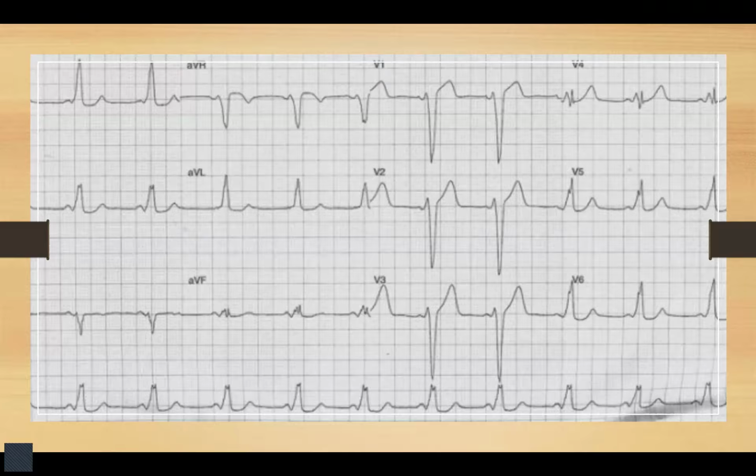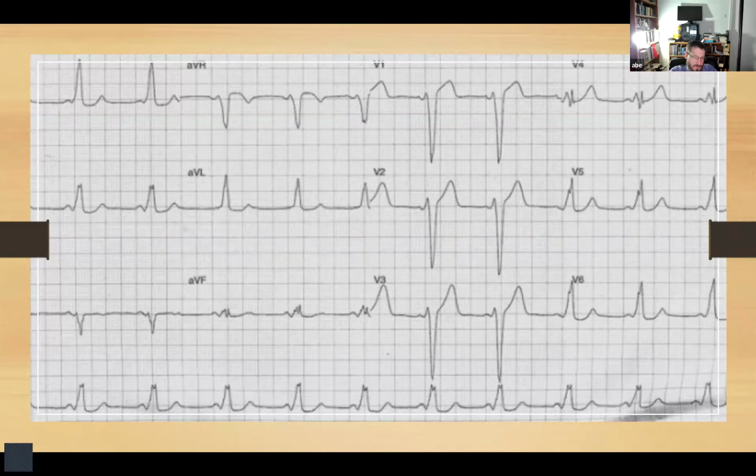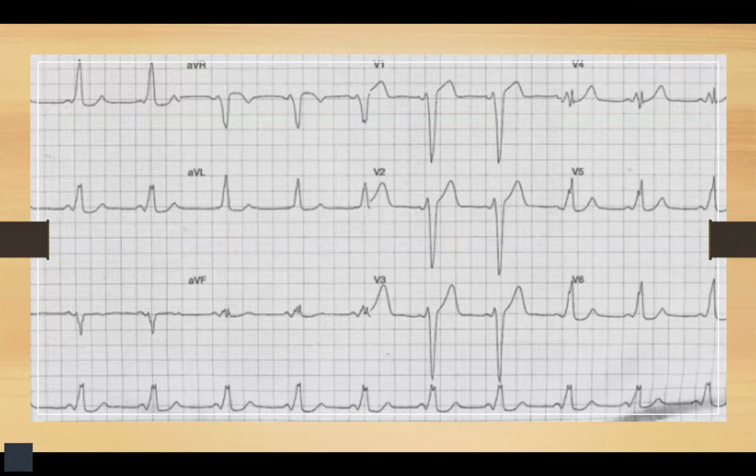What do you guys think about the rhythm strip? Anything jump out at you there? Yeah, really short PR. So now if we think about delta waves again, is that a delta wave? Yes. So this is another form of WPW.